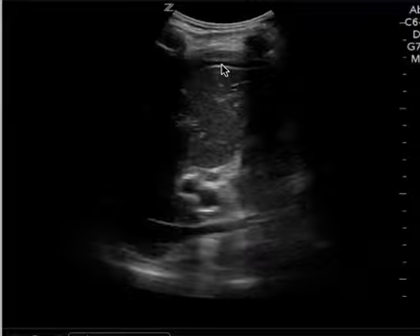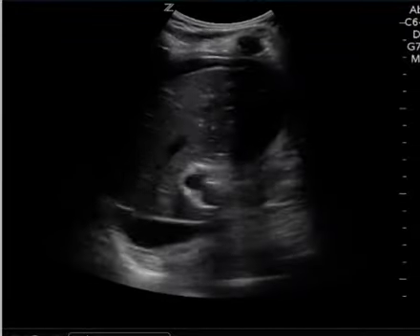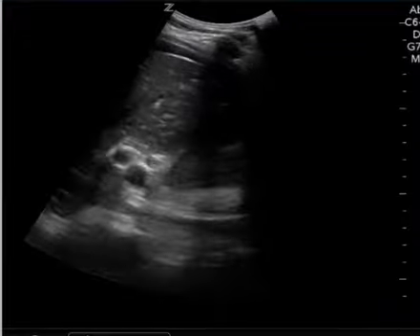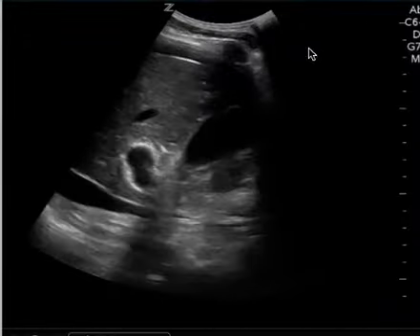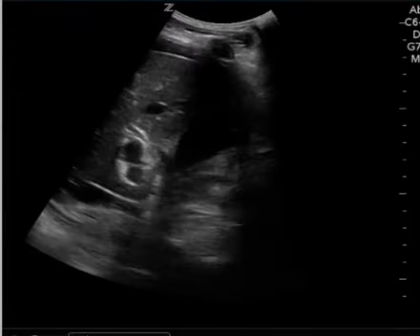In the other view here, same thing — you see this free fluid in this area. So the main take-home point: even though this was a gallbladder ultrasound, there's a lot of free fluid that you can see and it's definitely concerning. I hope this video helps — let me know if you have any questions.